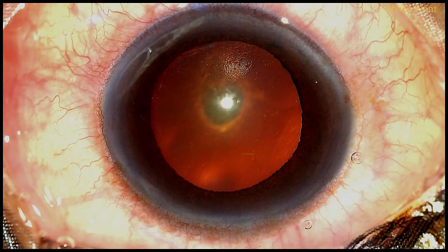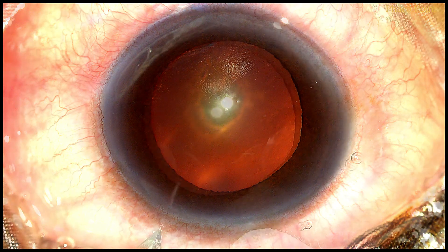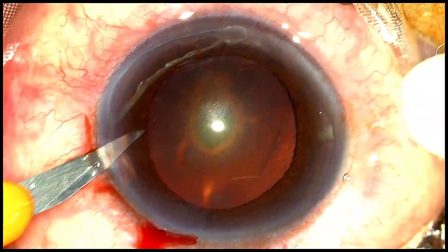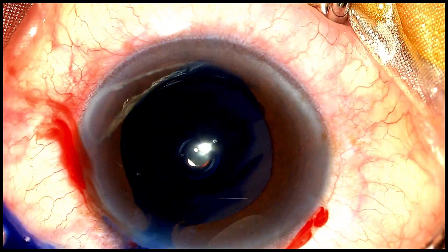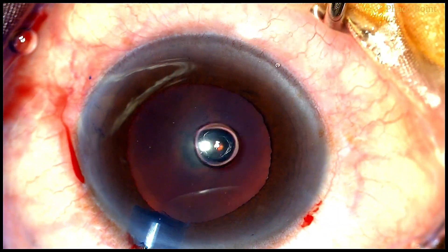Let's now move to watching the surgery. This is a patient with a posterior polar cataract with a grade 1 nucleus sclerosis. Like any other phacoemulsification, and most certainly in a patient undergoing posterior polar cataract surgery, meticulous care and attention to detail must be taken while making the incisions.